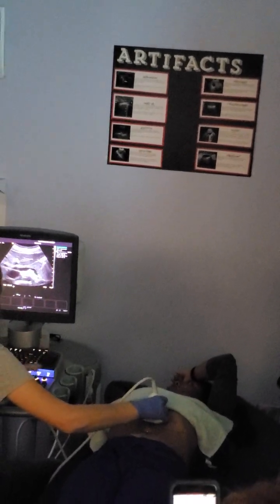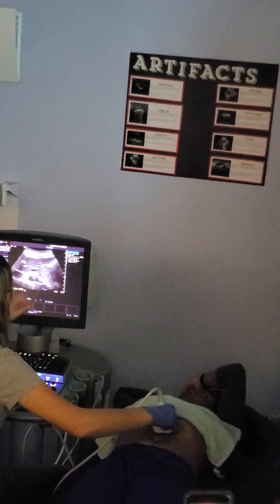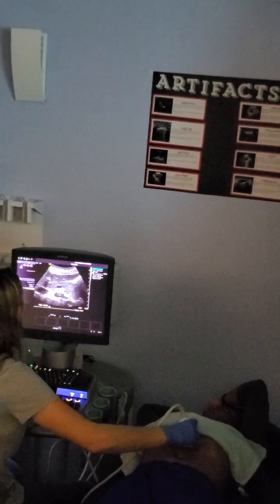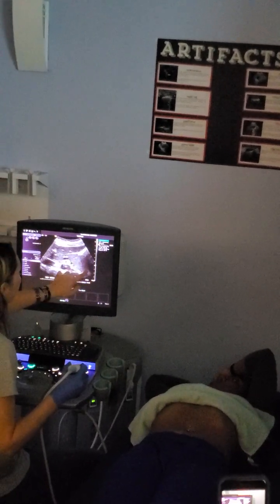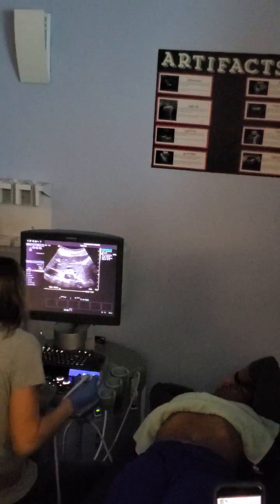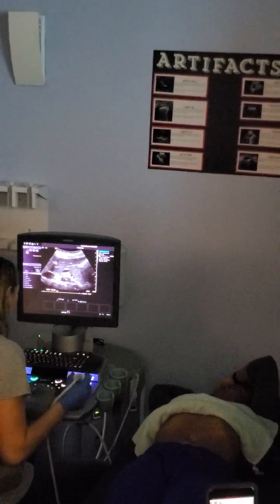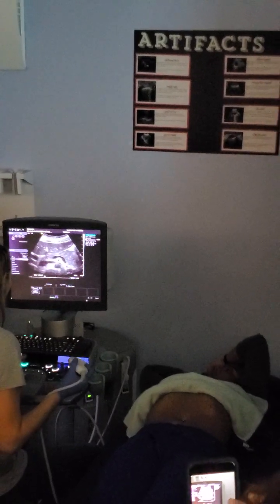We found that main portal vein. We saw him at 10 o'clock. We're just going to rotate to that 7 o'clock. And we're going to take 2 images. Go ahead, Brady, if you do 2. We're going to take one that has that uncinate head, neck really clean. And since we haven't seen the tail, we're going to take a second image showing that tail clean.